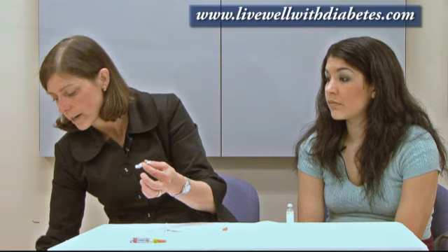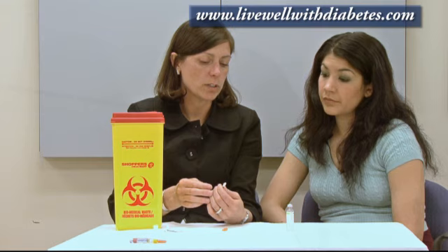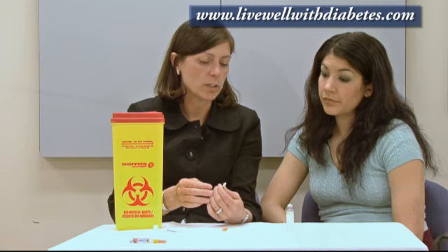This syringe is for one use only. Each needle comes with a little lubricant so it goes into your skin very easily, but every time you use a needle it gets a little duller. So the best practice is to use it once. When finished, don't bother recapping because people tend to poke themselves. Dispose of it directly into a sharps disposal container, a coffee tin, or a plastic container. Another option is a product called the BD safe clip, where you insert the needle and it clips the needle off. Use it once, then discard it.